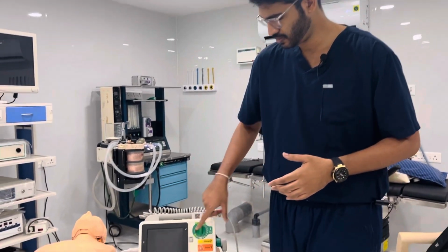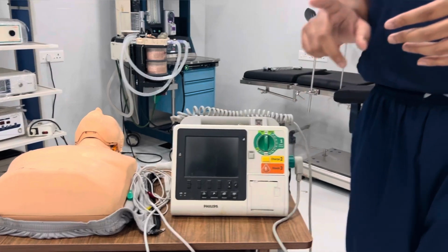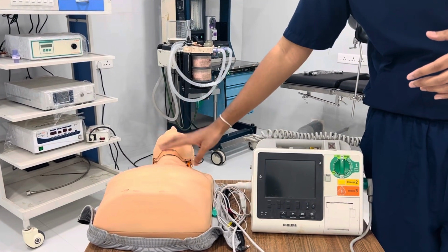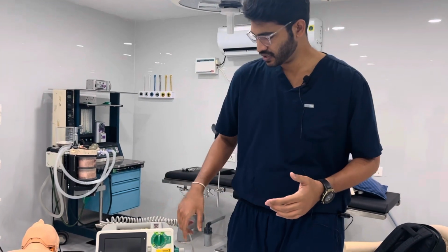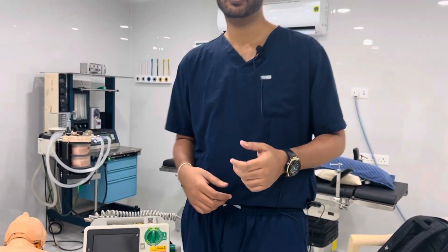For cardioverting, a particular energy is used for a particular rhythm. For example, if it is atrial flutter or SVT, we can select about 50 to 100 joules. If the patient has VT, in the meantime you have to check the pulse. If the patient has VT with a pulse, then you should select an energy of around 100 joules. And if the patient has AF, then you can turn the knob and select 120 joules, and you can give the shock.